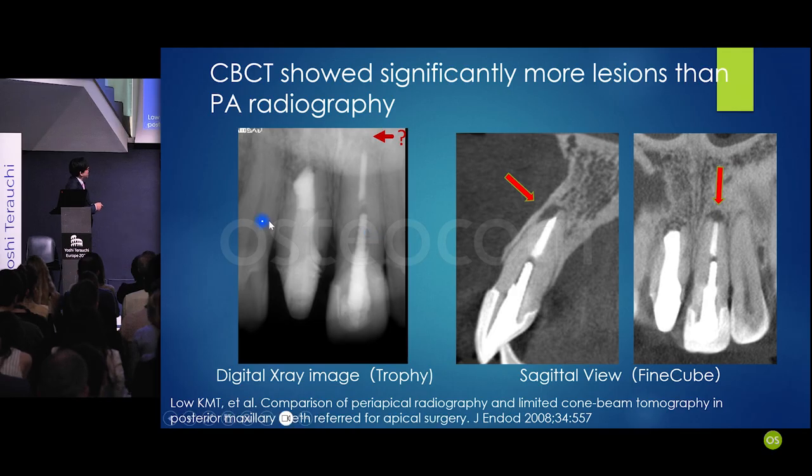If there's no lesion, I will not treat the tooth. But I found the lesion, so I retreated this tooth. And you see the external root resorption here.